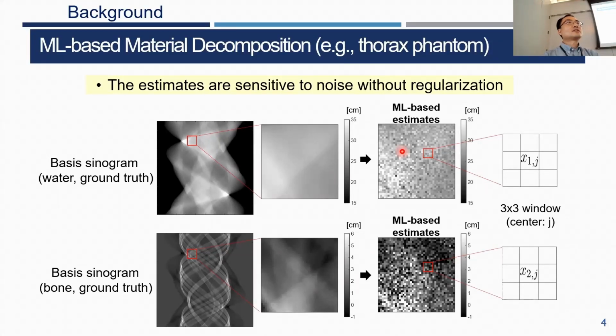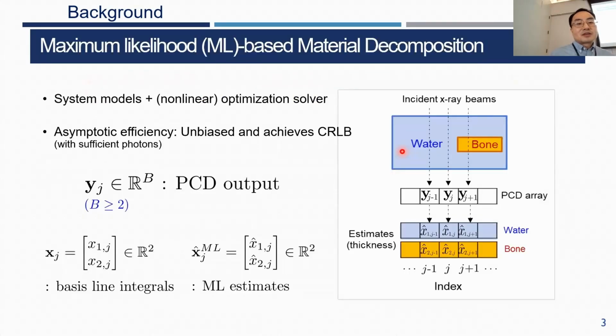Maybe, but with photon counting, you can calculate the likelihood, since it provides the Poisson statistics that we know. But my point is, it doesn't have to be just two. Three, four, any number of energy bins is okay as long as we can calculate the likelihood and ML-based estimation. Oh, I see the point. So you're considering more than one energy window. I understand.